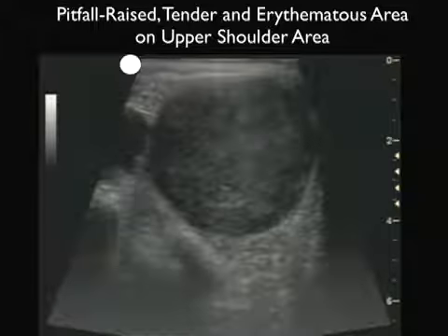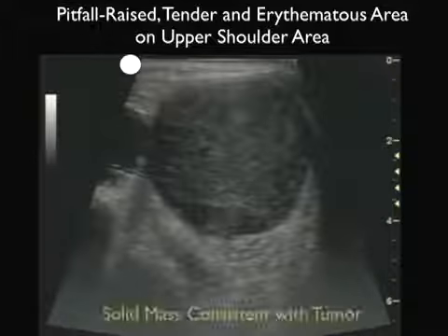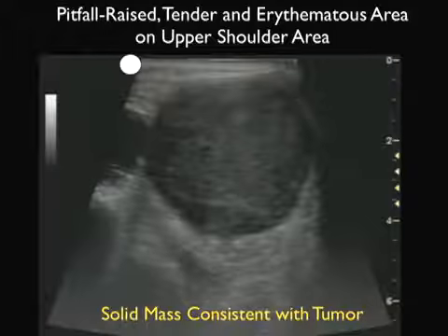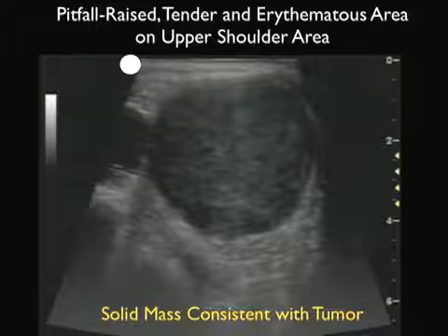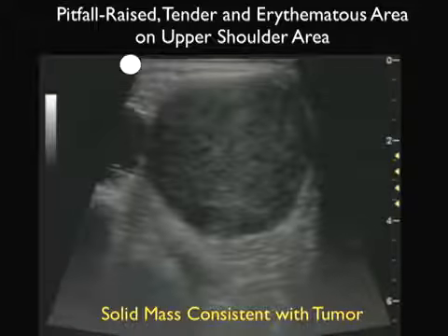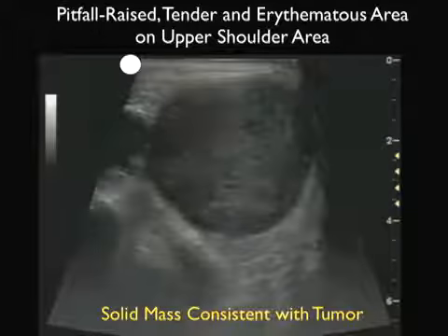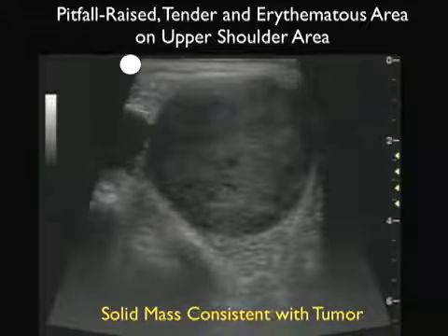This video clip shows another potential pitfall. This was a patient who presented with a swollen red indurated area on the top of the shoulder. As we scanned back and forth through the area, initially it looked like a pus ball, but on further examination it looks more like a solid mass. Pushing down with the pressure of the probe failed to give the appearance of the typical movement of pus within the cavity. This, in fact, turned out to be a solid mass consistent with a tumor that had spread from a patient's underlying lung cancer, something to avoid as a pitfall in an incision and drainage procedure in the emergency department.